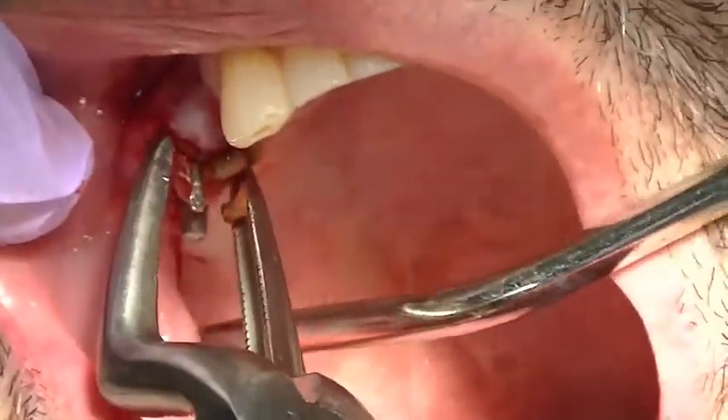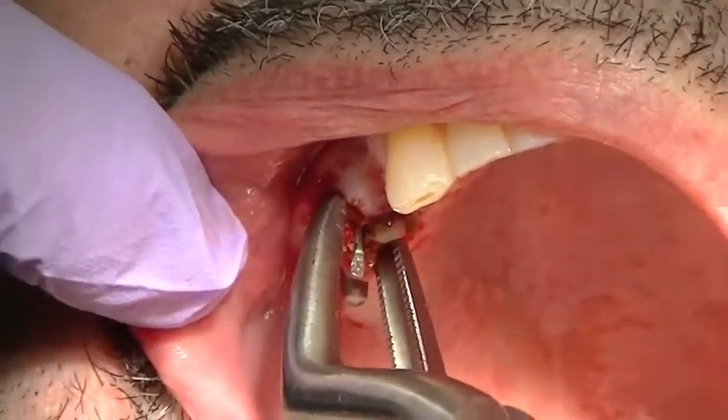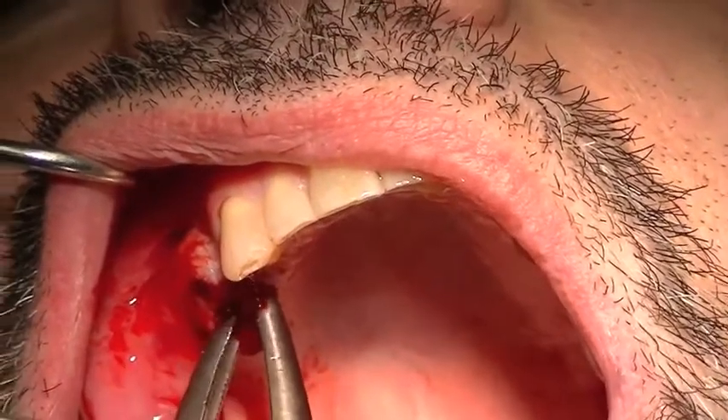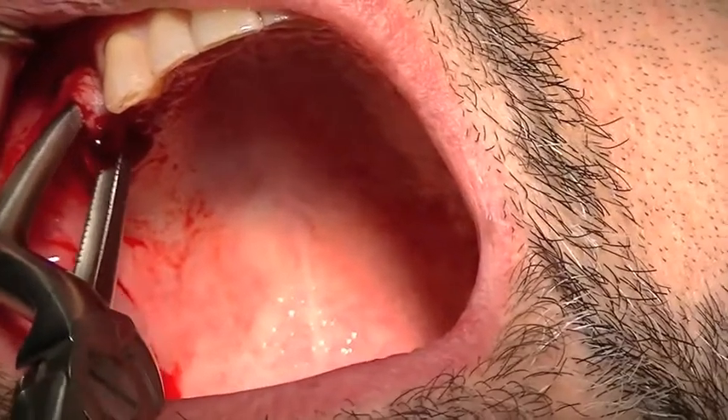You can see how badly decayed this tooth is. The tooth is actually fractured vertically — I was able to remove one piece, and we'll go in and simply remove the other broken, fractured root tip from the socket.